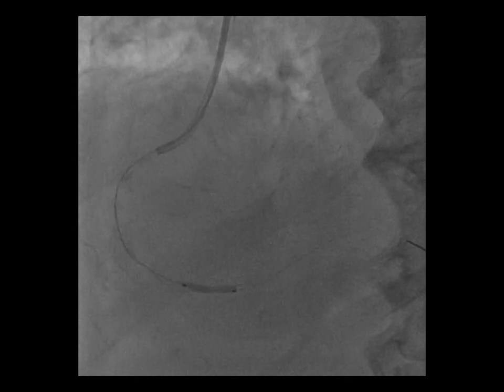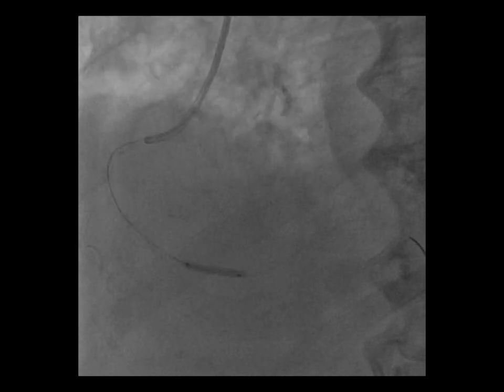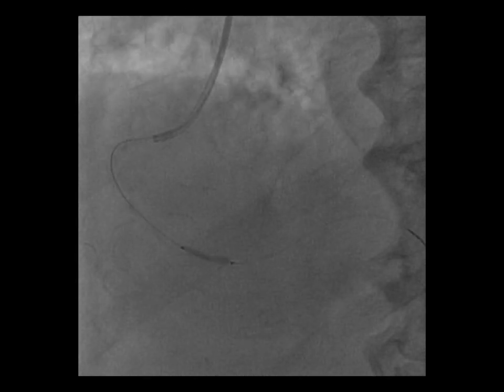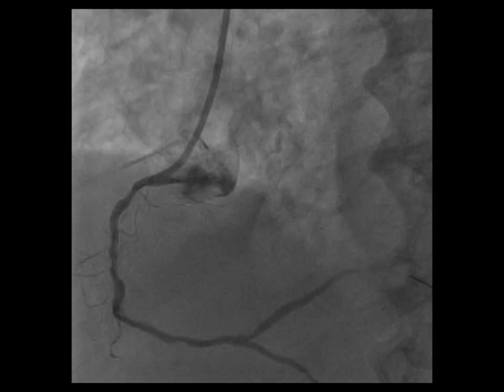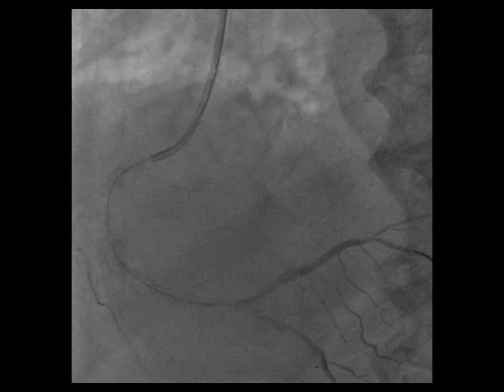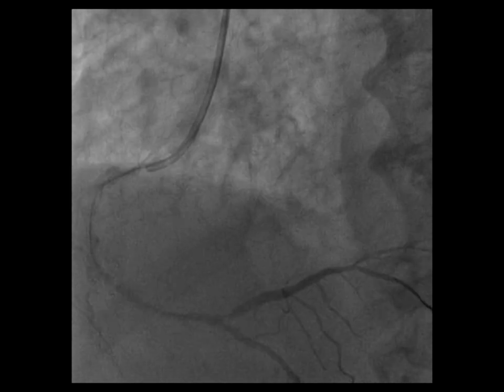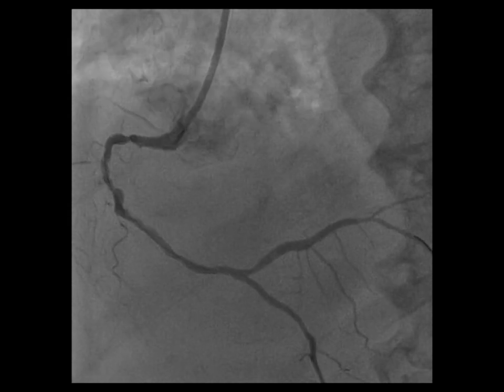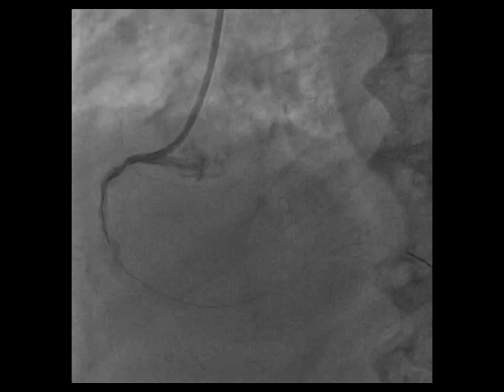Because we had a significant residual narrowing, we decided to inflate further for better lesion preparation using a 2.5 x 15 mm non-compliant balloon. You can appreciate the extensive diffuse calcification involving the proximal, mid, and distal segments of the vessel. After the non-compliant balloon dilatation, we had good distal flow, the significant residual narrowing disappeared, even the dissection looks better, and we thought the vessel was ready for stenting.